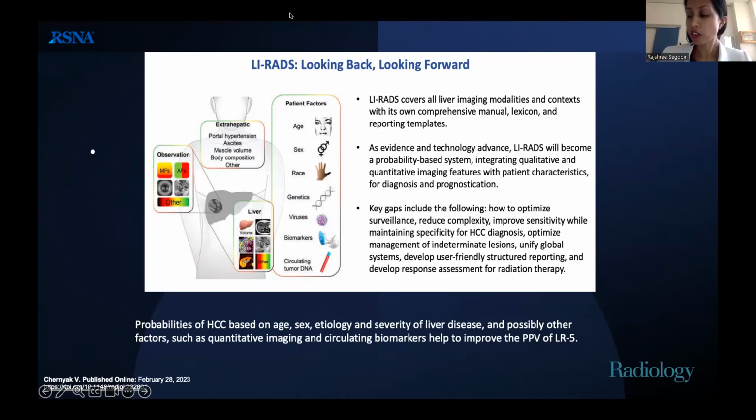So we would use the Hounsfield unit to quantify more on the CT. Okay, but is there not another measurement that you can use apart from Hounsfield units on the MRI to actually get a number where you can say it's definitely hyper-enhancing or washout, or is it just a subjective thing? You can definitely do that to look at the soft tissue and the difference in the parenchyma. But my experience is that we classically use it more in CT imaging.